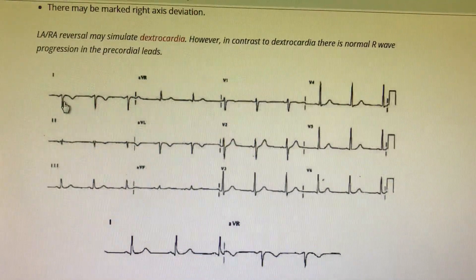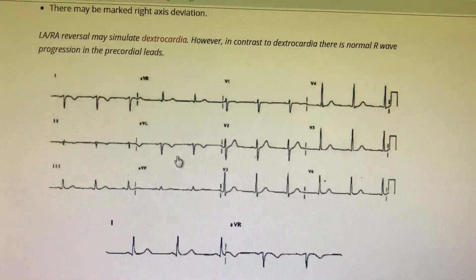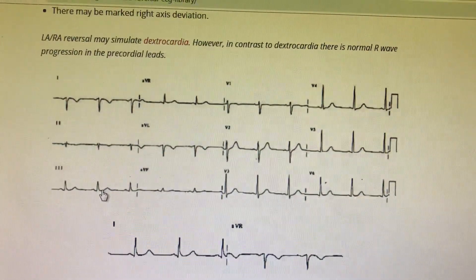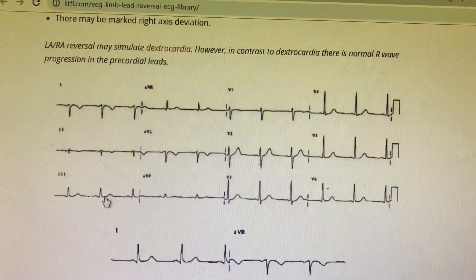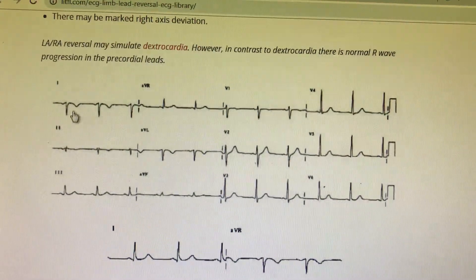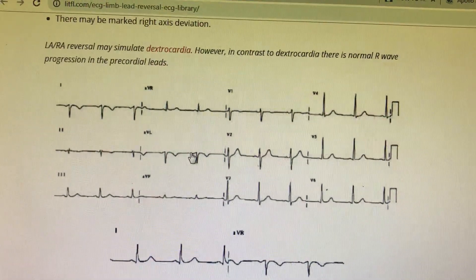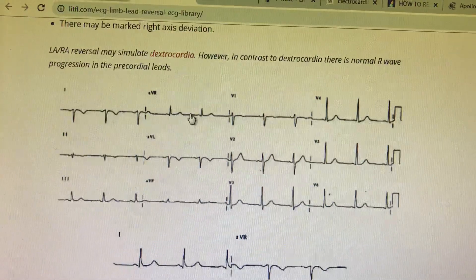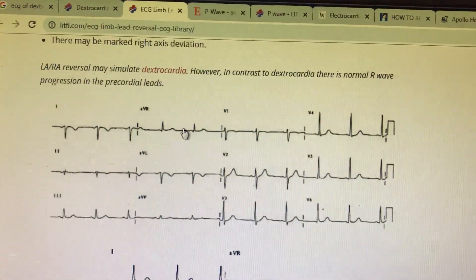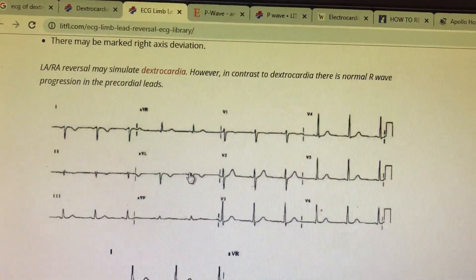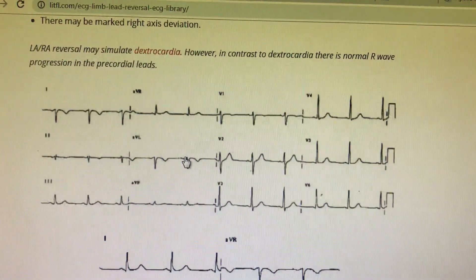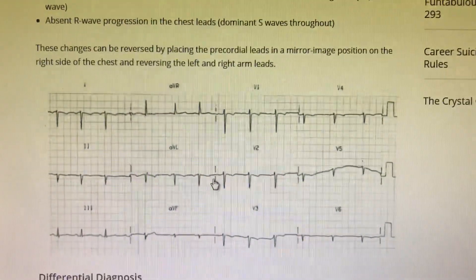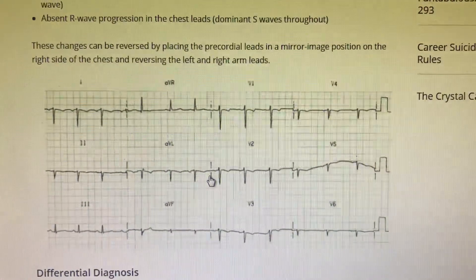Then go to lead I — everything is negative — and also AVL, everything is negative. Lead III is almost more positive than any other lead. So this is most probably right axis deviation with inversion in lead I and AVL, and everything being positive in AVR. This gives us the suspicion that the patient has a limb lead reversal.